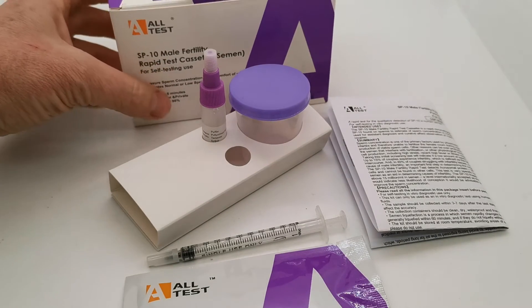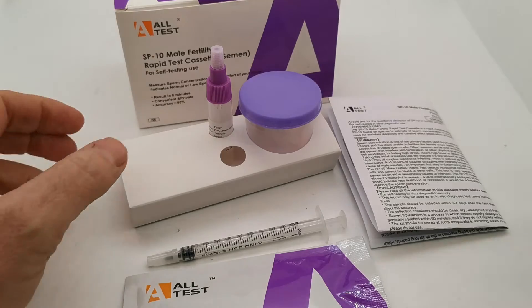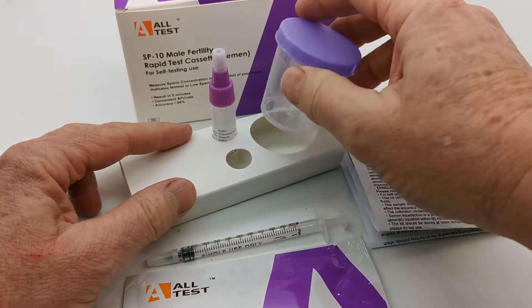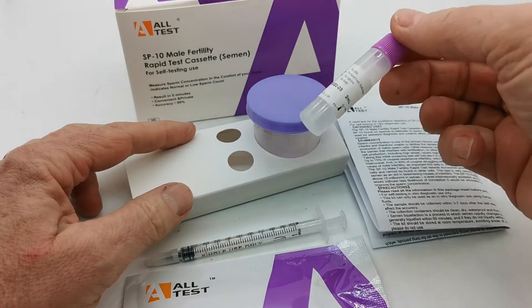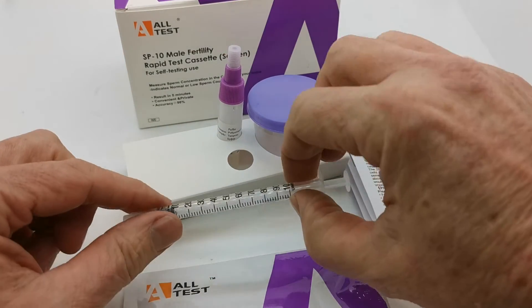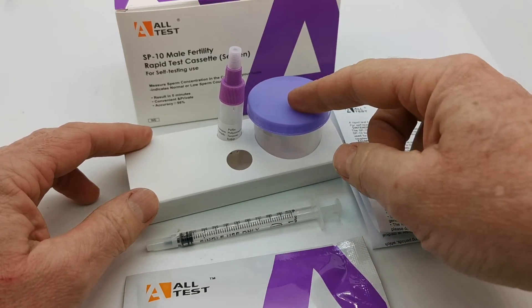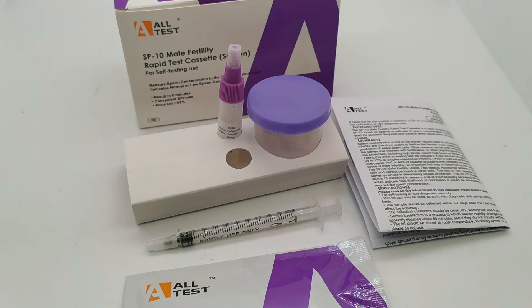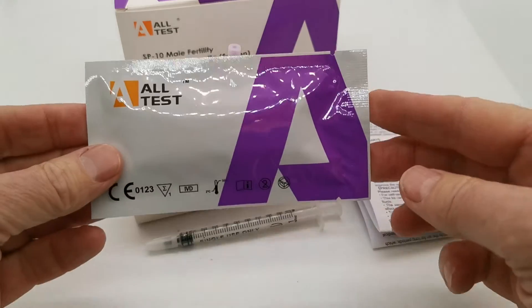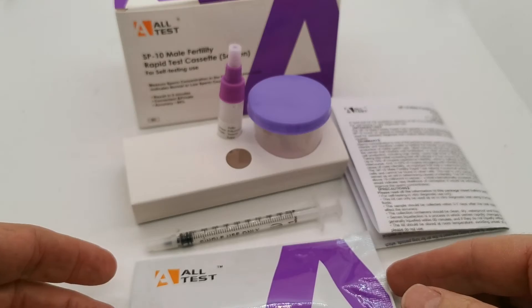What you get in a pack is a complete home male fertility check. It includes a collection vial, a sample container with two mils of the buffer solution, a graduated syringe to enable collection of the correct proportion of the liquefied sample, and in the foil pouch is the test cassette which runs the test for you.